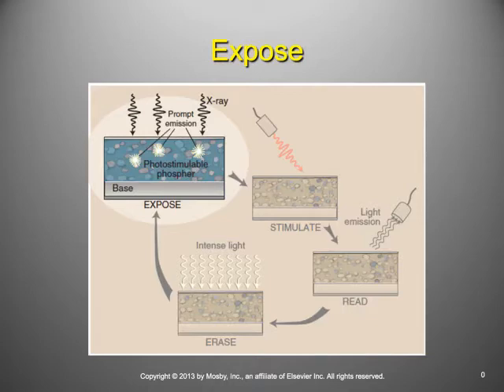A significant thing about the PSL, this photostimulable luminescence system, is that it operates very similar to the OSL that you wear to detect radiation. So inside of this badge that Landauer produces is an optically stimulated luminescent crystal.